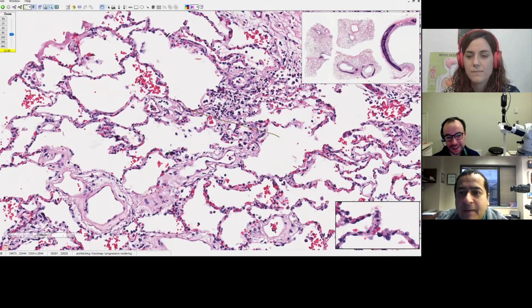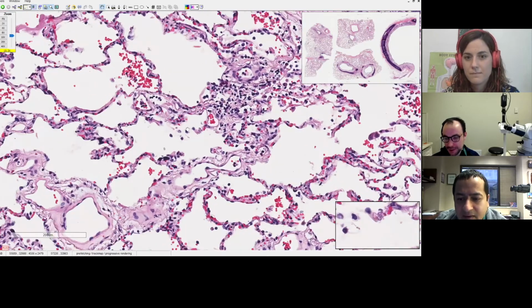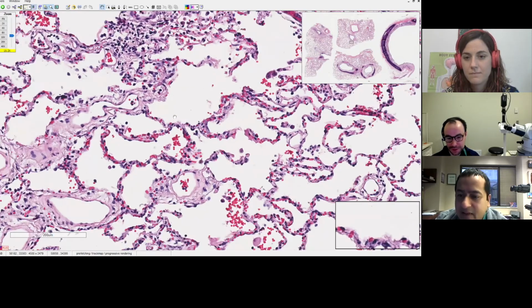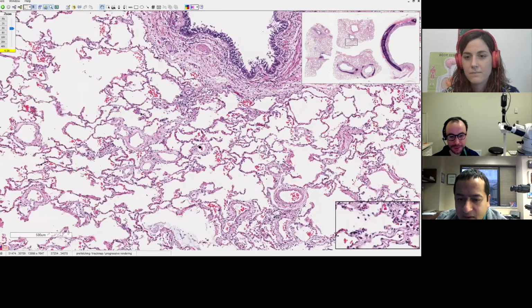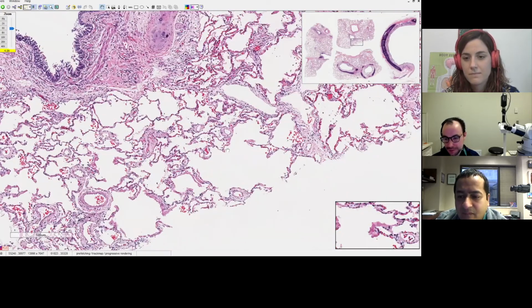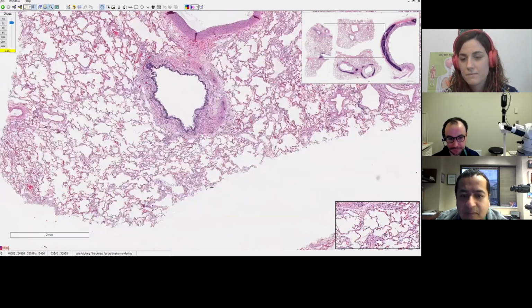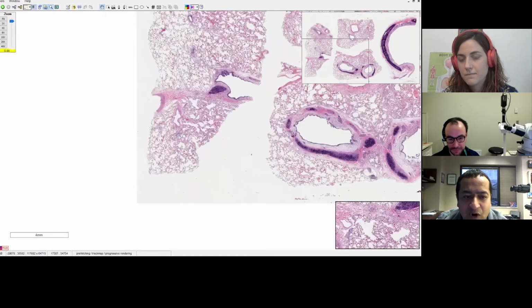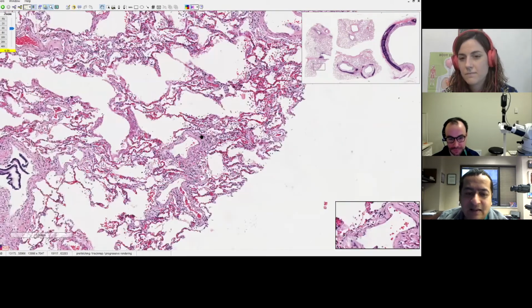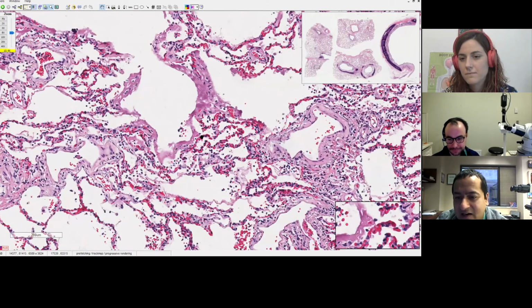autopsies. The other thing I noticed in this case is the interstitium is really not that expanded. So maybe that's just because it's fairly early on in the DAD process. It's really more in that kind of acute exudative phase. Yes. There's really no organization. There's really no proliferation of fibroblasts or anything. Yes, that's exactly right. And that pretty much is true wherever you go into these abnormal areas, that the alveolar septa are almost normal, but it's a very early stage. Congestive a little bit.